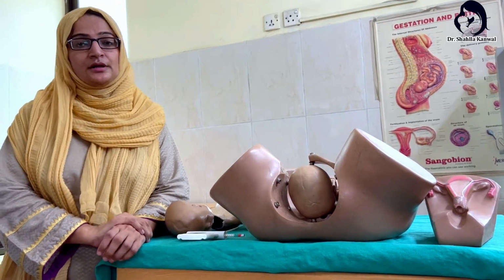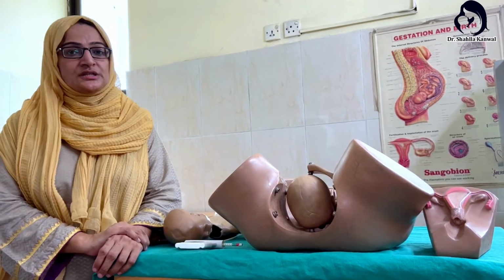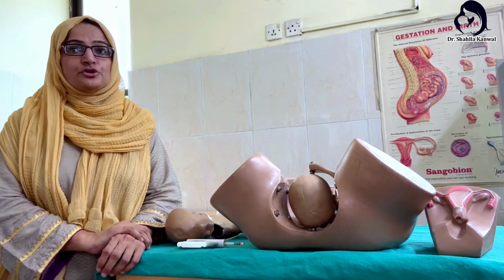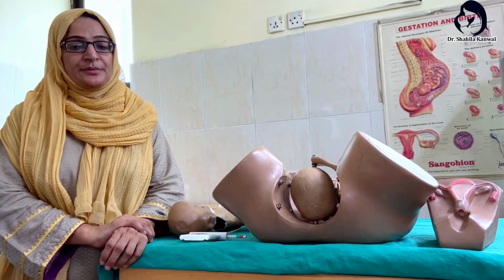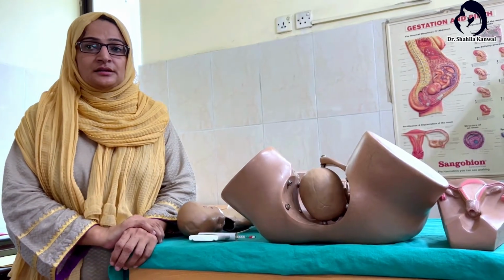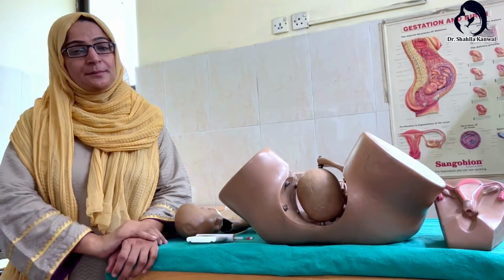Prerequisites will be the cervix should be fully dilated, membrane should be ruptured, presentation should be vertex, and vertex should be occipito-anterior position. There should be no cephalopelvic disproportion, and on abdominal examination, baby should be of term fundal height or baby should be of more than 37 weeks, and there should be adequate uterine contraction, 3 contractions per 10 minutes, and every contraction should be of less than 1 minute. These are all the prerequisites which we should follow for the ventouse delivery or the Omni cup delivery.